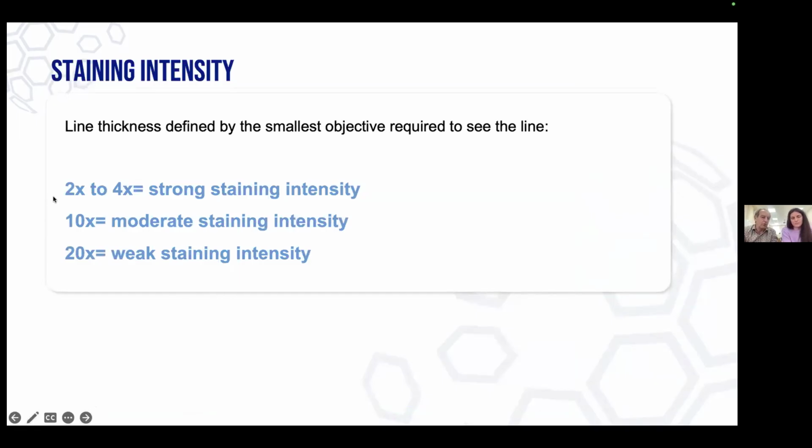Originally, the magnification rule was to use a low power, and if you see membrane staining at low power, this is strong staining intensity. An intermediate power, which was 20 or 10, defined moderate staining intensity, and a high power, 40, decided weak staining intensity. For a lot of reasons to do with our understanding of membrane staining in PDL1, we've decided that times 40 is a dangerous lens to use now, more or less. So be careful about times 40.